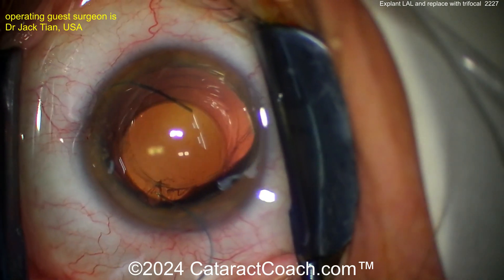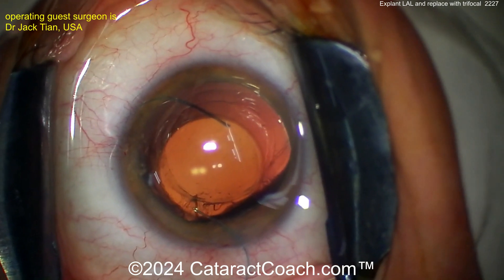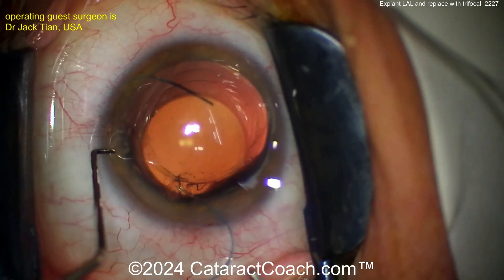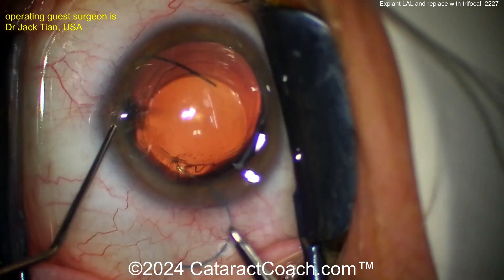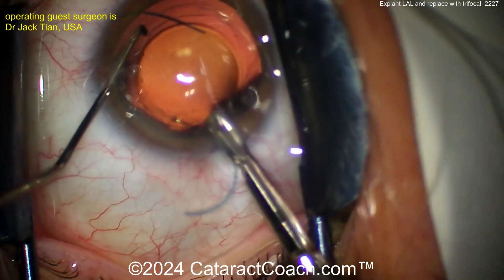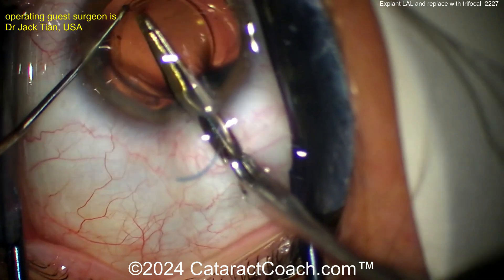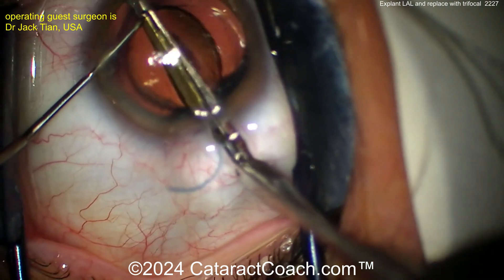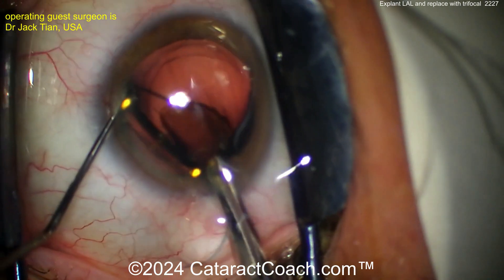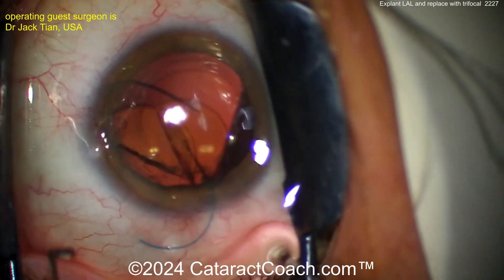With a silicone lens like this, I agree — I'd like to cut it in half. It's a slippery lens, especially with the anterior chamber full of viscoelastic. The silicone optic is going to be slippery, so what you want to do is exactly this beautiful technique: using the chopper in one hand to help stabilize the optic while you place the scissors inside the eye. These are intraocular cutting scissors — be careful not to touch the posterior capsule. And you can see the lens bisected very nicely in the anterior chamber.